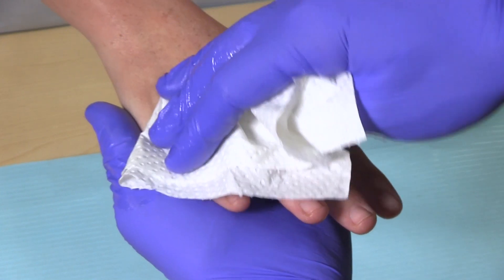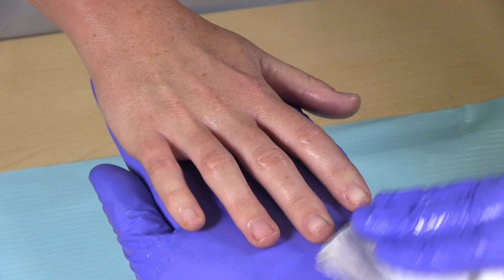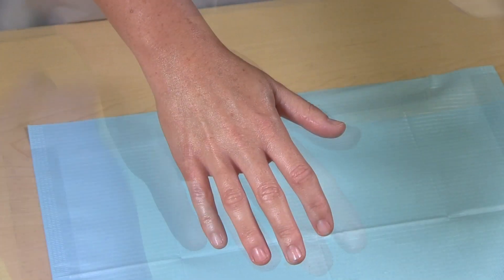Paper towels may be used to remove excess Vaseline. Customers may also shave excess hair if desired.